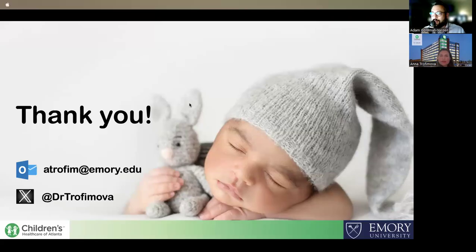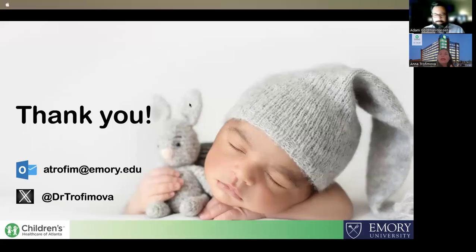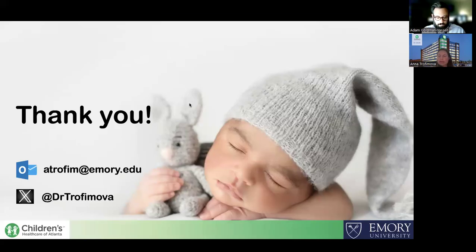And then when do you recommend imaging for HIE? 3 to 7 days, or when would you recommend doing the MRI? Like I mentioned during the presentation, the best time to image is somewhere between 3 to 5 days. In many cases it's also driven by the clinical course, hypothermia and other measures they're doing. So often it's not so much when we would like to scan the baby, it's when the baby is ready for MRI. But in terms of the best window, it's somewhere between 3 to 5 days.